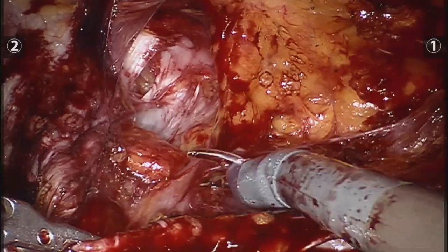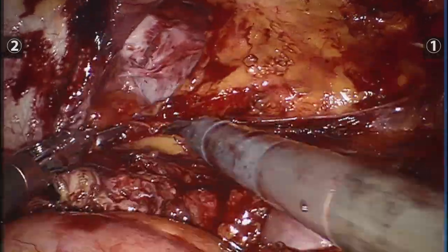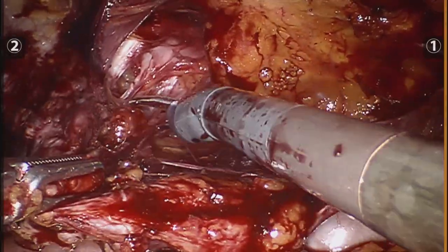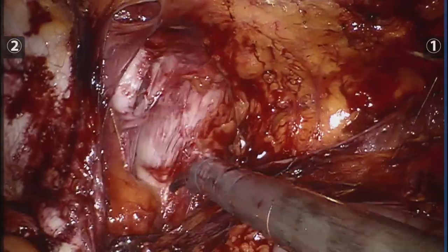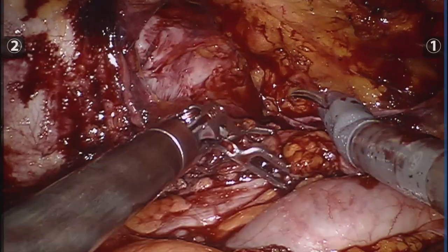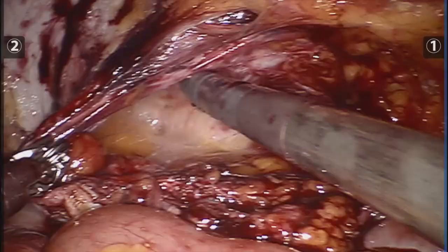We are going to start the TAR on the left side. As I said, I am a right-handed surgeon so it felt more comfortable going bottoms-up this time, and this is also the way I find more comfortable and more precise when I do it in laparoscopy.